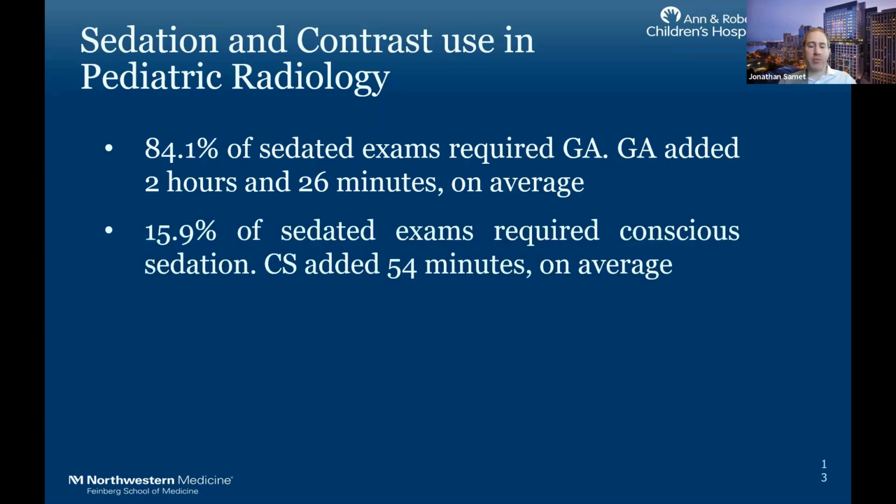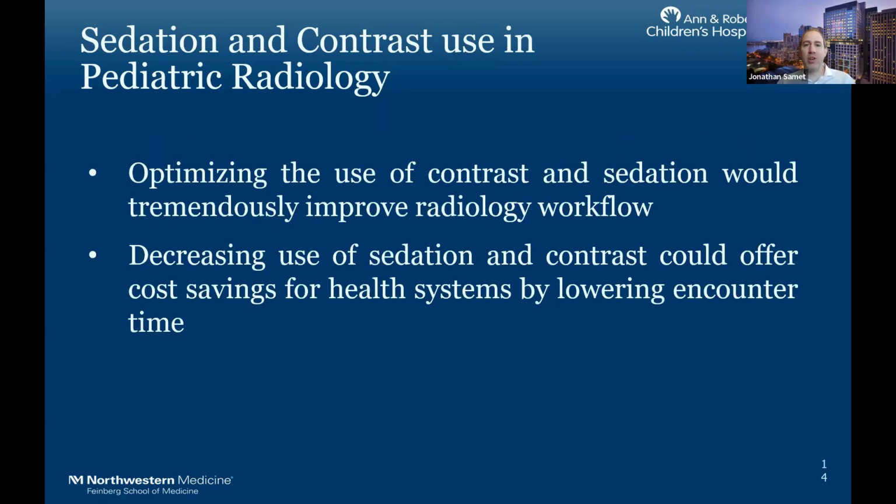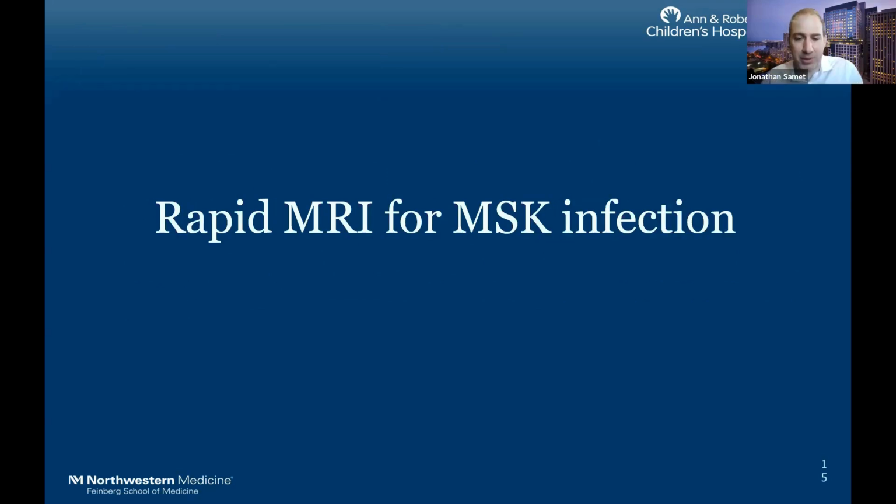15% of the sedated exams were conscious sedation. If you checked off conscious sedation, it adds 54 minutes. So we need to optimize the use of contrast and sedation in order to improve radiology workflow. Decreasing the use of sedation and contrast can offer tremendous cost savings for the healthcare systems by lowering the encounter time, as hopefully I can explain to you.